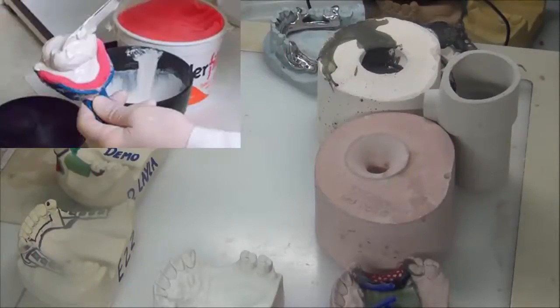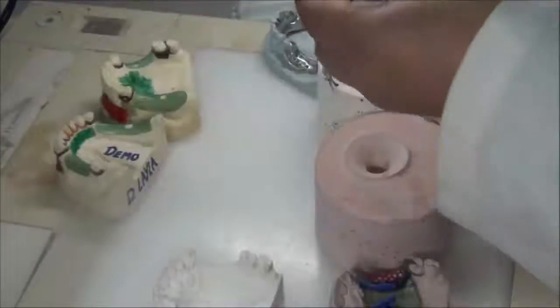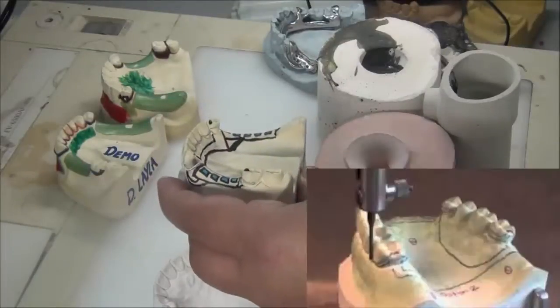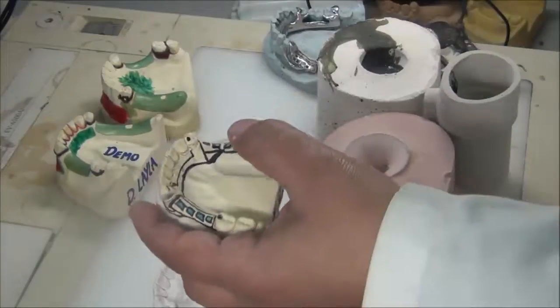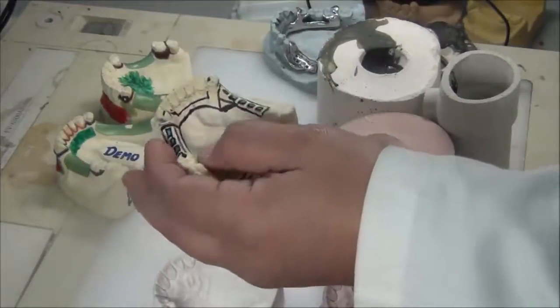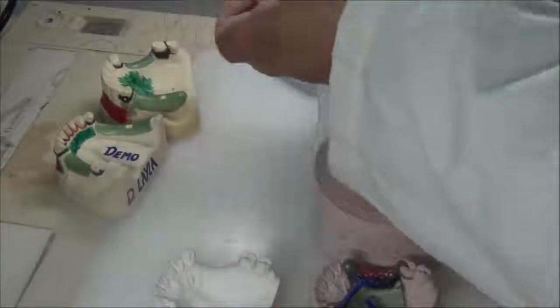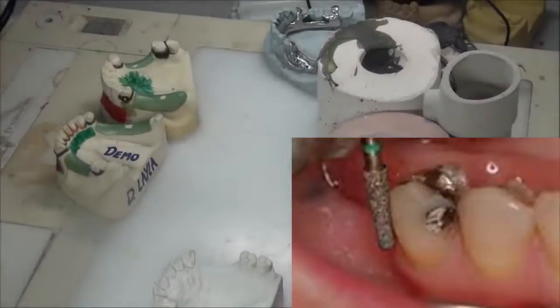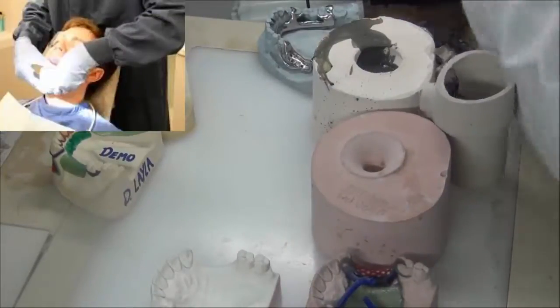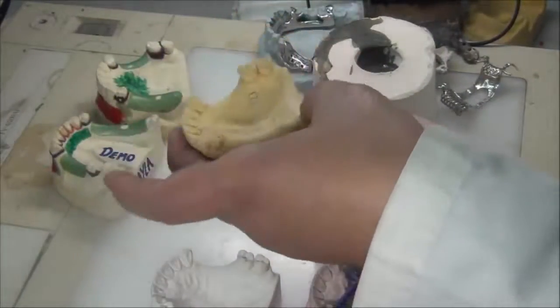In lab two, we poured these impressions into primary casts, and these primary casts were used to draw a design using the surveyor. We decided where we need a rest, a guide plane, or where we have a high survey line. Many teeth needed to be altered, so this went back to the clinic where we prepared the teeth, took a secondary impression, and got a secondary cast with all dental preparations ready.